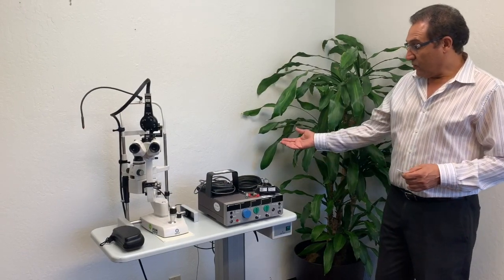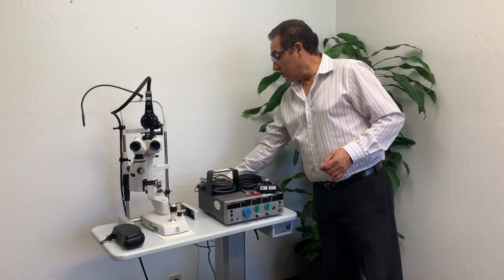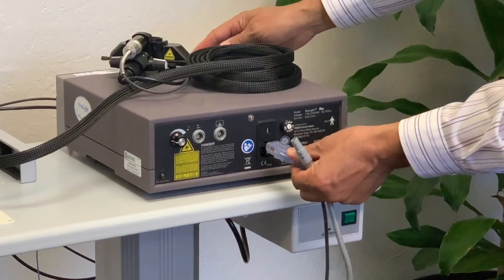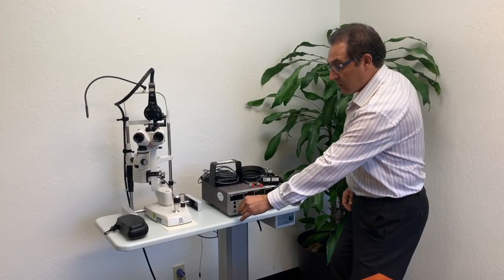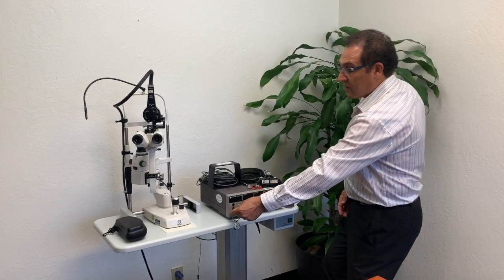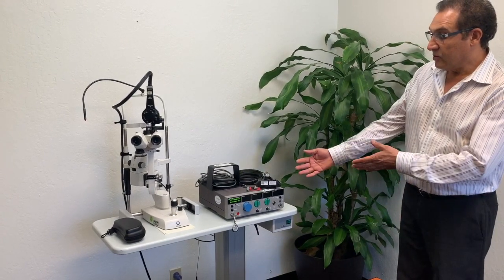We have to have the connection to the wall, which is the AC inlet. The AC inlet goes at the back of the laser, and the key goes to the off and on key. Now you can turn the laser on and follow the sequences.